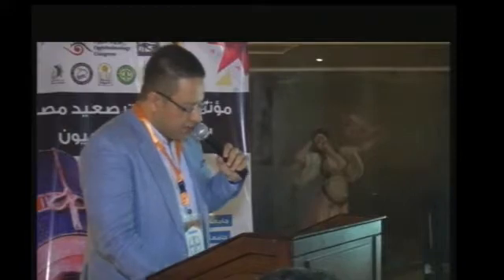طبعا لو في فيترس لازم يبقى كنت عامل جود انتيريور فيتكتومي. طيب انت بقى كده بعد ما حصل رابشر بوستيريور كبسول، الاي او ال اوبشنز المتاحه قدامك حسب الكونديشن قدامك. لو الريكسس انتك ممكن تحط مالتي بيس اي او ال في السالكس.